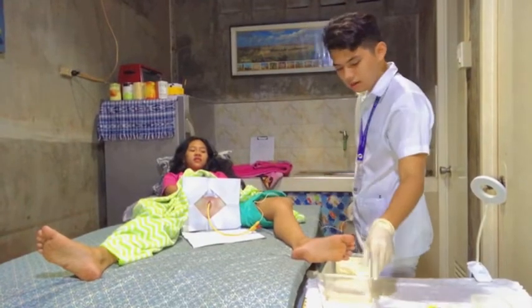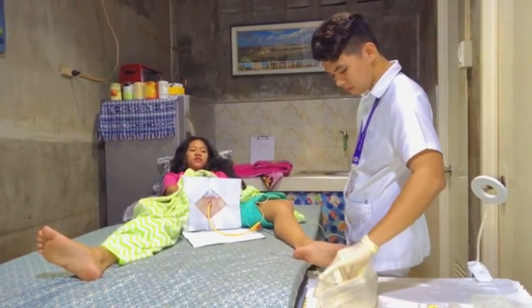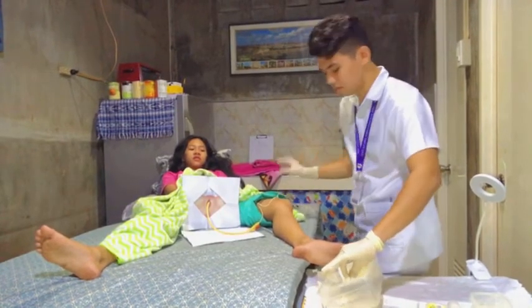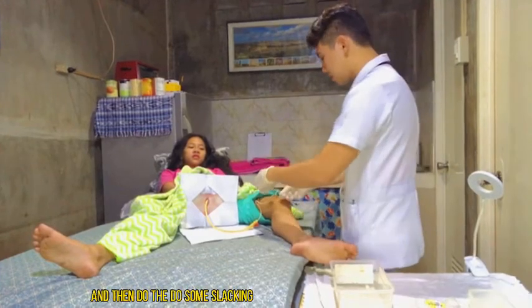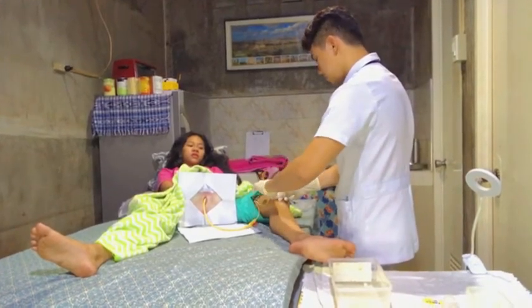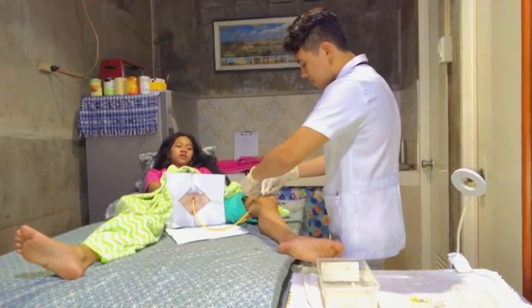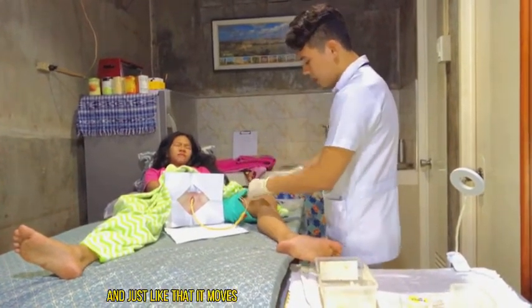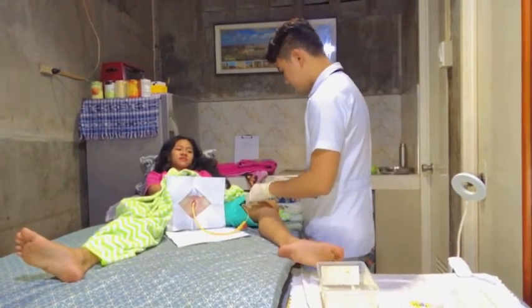So get your catheter tape and then do some slacking. This is just an improvised catheter tape. And just like that, it moves. Okay.